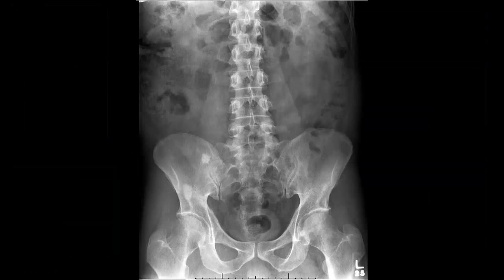Let's go over a basic approach to reading abdominal radiographs. We'll start with this patient here and look at supine and upright views of the abdomen. I'll go over my general approach and try to keep it simple without overwhelming you with details. The first thing we'll take care of is the most common indication these are obtained for, which is going to be obstruction — that's going to require evaluation of the bowel gas pattern.